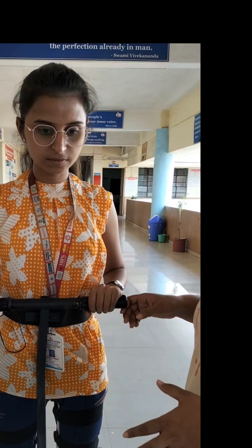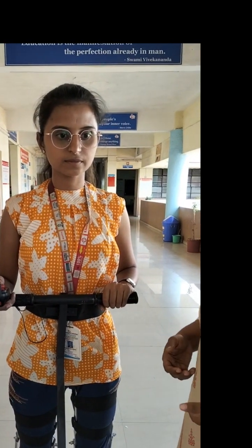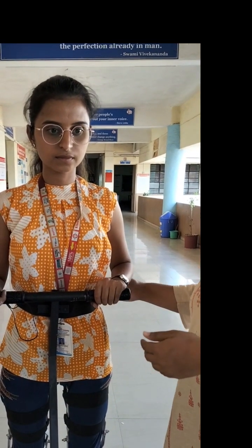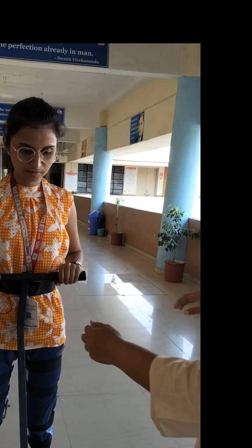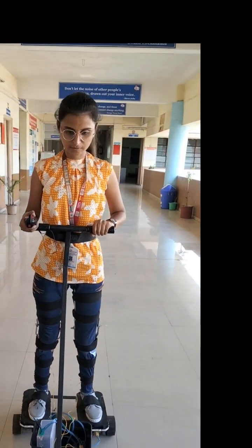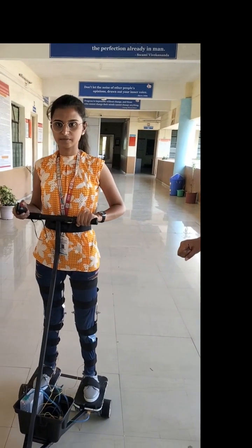This position is useful for orthopedic and lower-limb disabled patients. This also provides a safety belt which helps polio patients or old-age people to avoid bending forward. Now this can work in this position, and the person can have handle support to work with the help of the support.